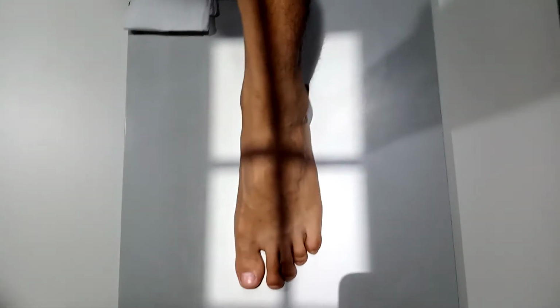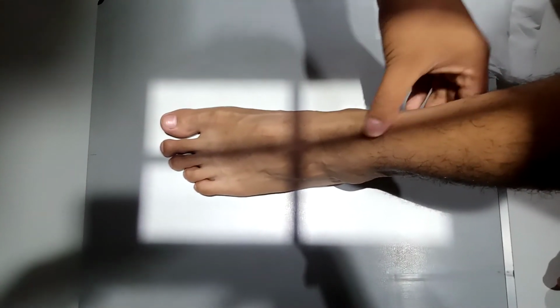In positioning, the patient must be seated or in a supine position with the plantar surface of the foot flat on the IR and aligned lengthwise to the portion of the IR being exposed. Extend the foot by sliding the foot and IR distally while keeping the plantar surface flat on the IR. The central ray must be directed about 10 degrees posteriorly, towards the heel, perpendicular to the metatarsals, and must be centered at the base of the third metatarsal. So, base of the third metatarsal.